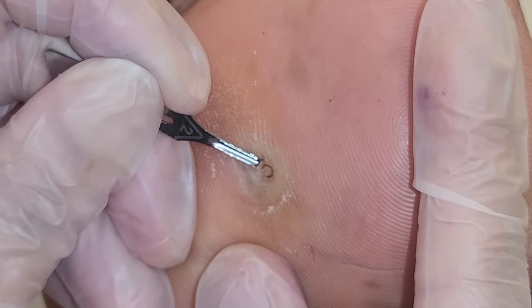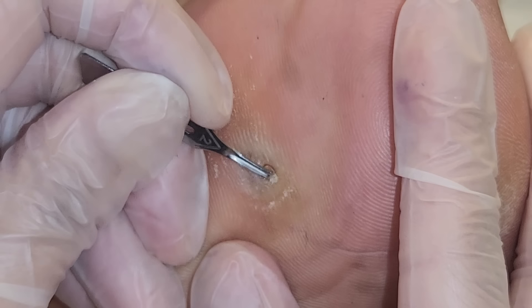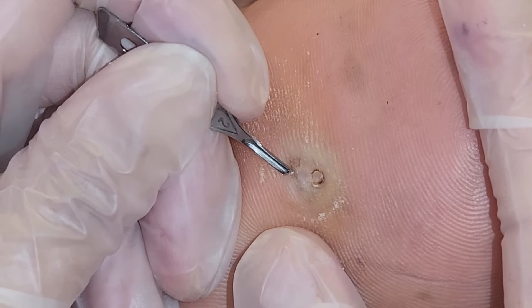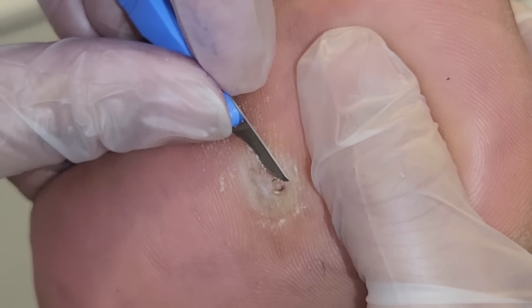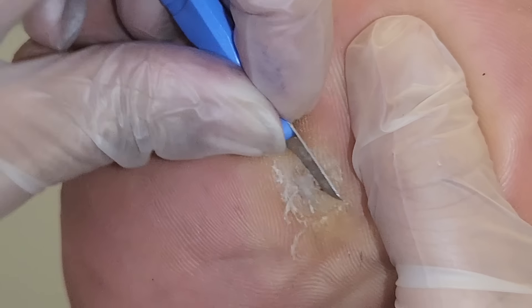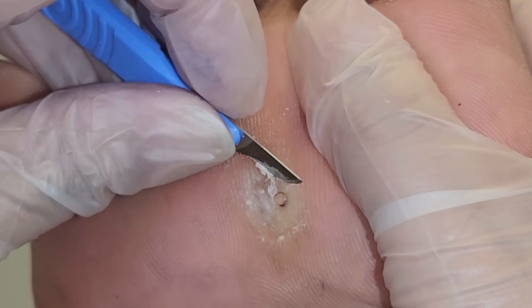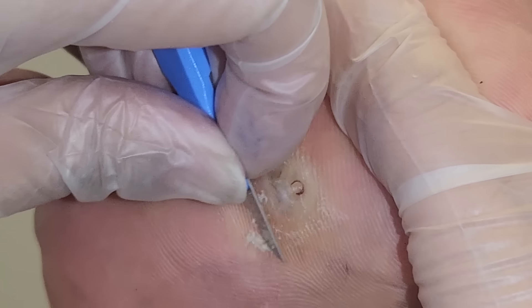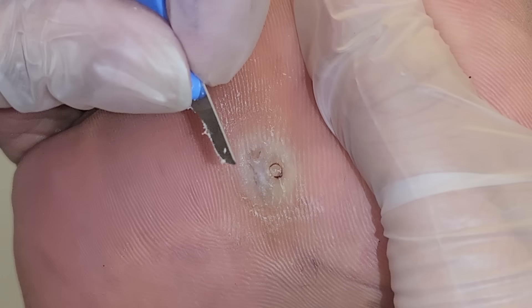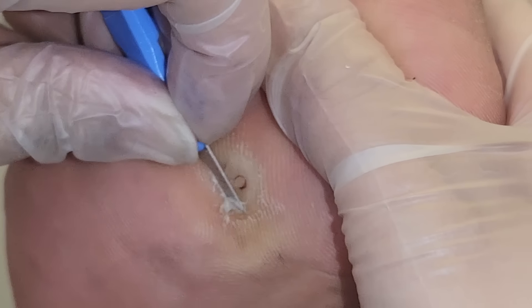I'm doing it very gently, okay. It's very sensitive. Well done. So this top bit here is quite sensitive, isn't it? So the lesion is quite big. So if we did need to surgically remove it, it would be a very, very big kind of cut in the foot and it will take a while for it to heal. Just slowly scraping it, okay.